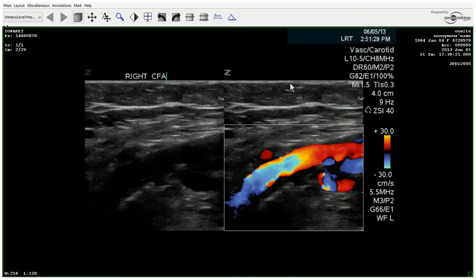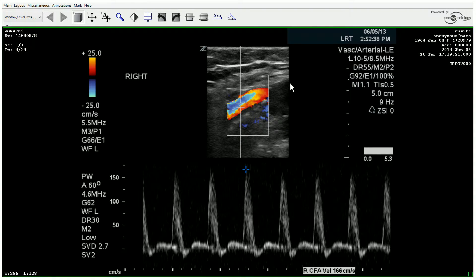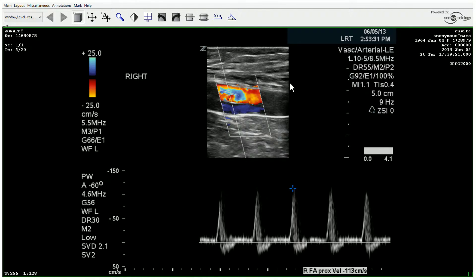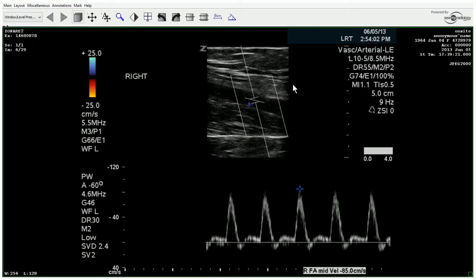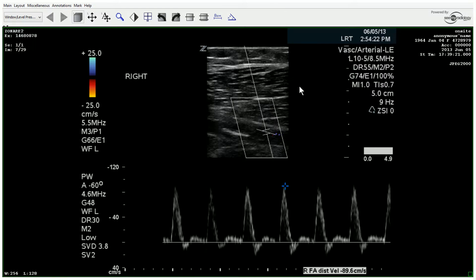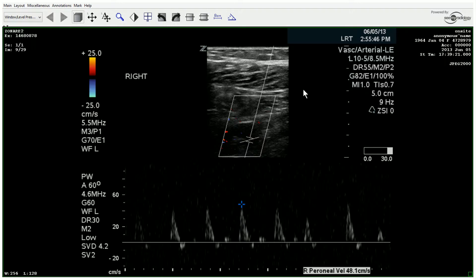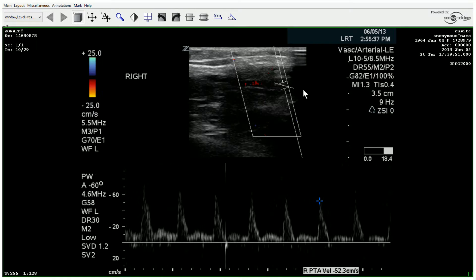We begin our exam. You'll notice the 2D and color image of the right common femoral, and here's your spectral Doppler. We can move through the right side pretty quickly, considering we already know the ankle pressures. We should expect a fairly normal duplex of the right lower extremity. And indeed, all the waveforms appear triphasic all the way to the ankle.